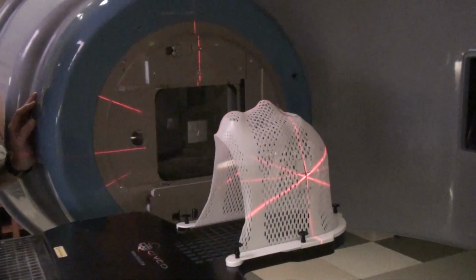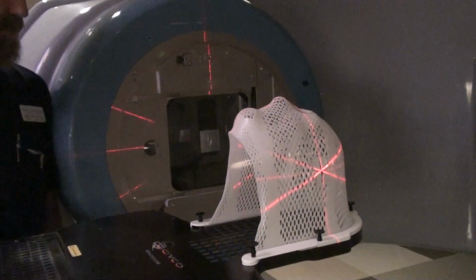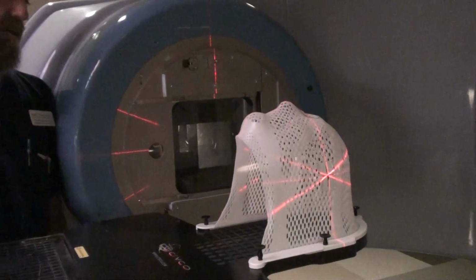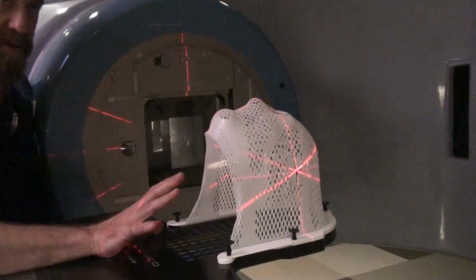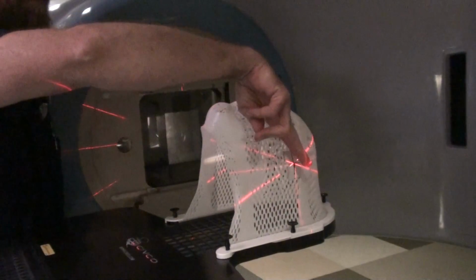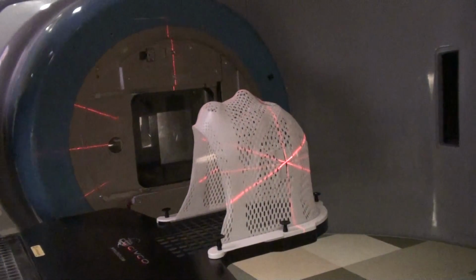We discussed in class the fact that you have specific borders that you have to be mindful of. I'm going to set a field. I don't actually have a patient called up that corresponds with this particular mask. But I'm going to set what is essentially a whole brain treatment. Your normal borders for a whole brain are going to be from outer canthus to the mastoid tip or tragal notch, okay? You're basically going to be blocking, I'm doing this backwards so it's difficult, I'm sorry. Let me turn the collimator so that it actually reflects what I'm talking about.